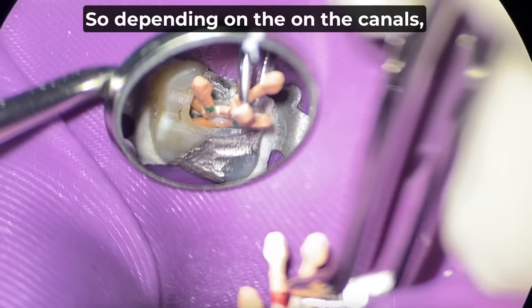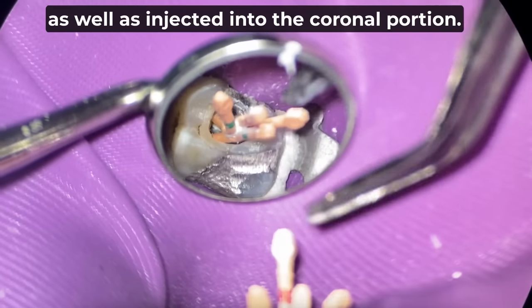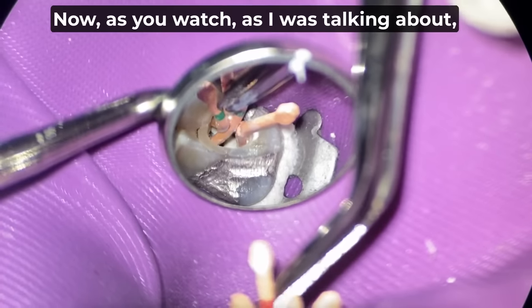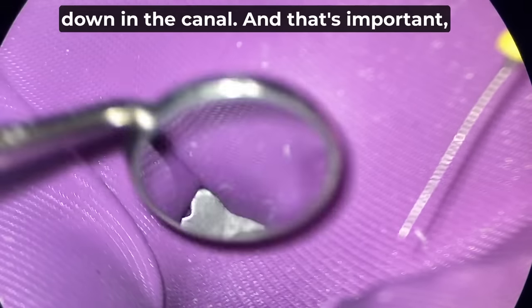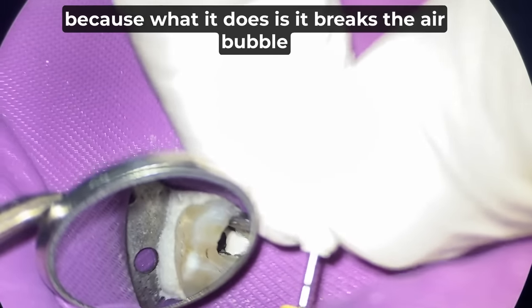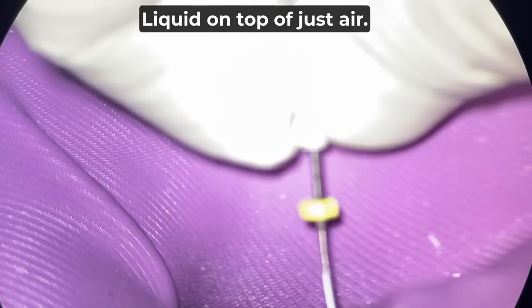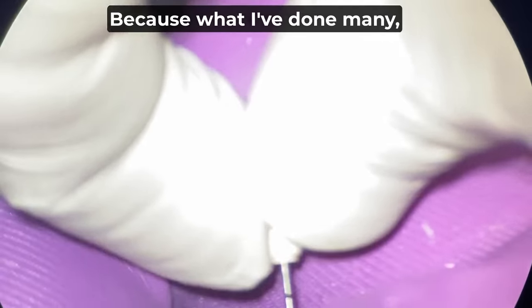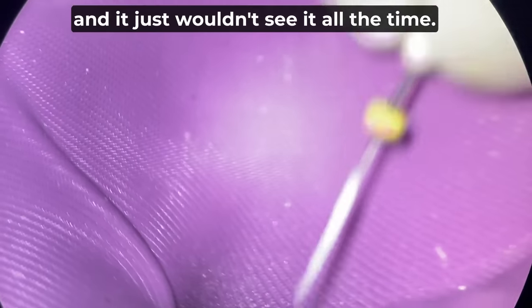Depending on the canals, I'll put BC sealer either onto the cones as well as injected into the coronal portion. As you watched, you probably saw me take a 15 file and go up and down in the canal. That's important because it breaks the air bubble underneath the BC sealer. If you inject a liquid on top of air, the air needs to get out of there. Many years ago I tried to place my cone on top of that and it just wouldn't seat all the time.